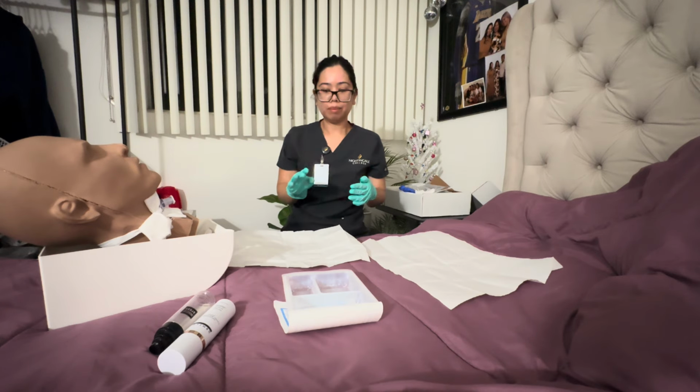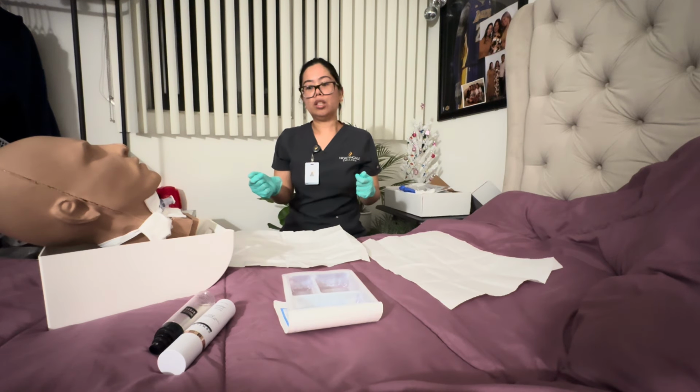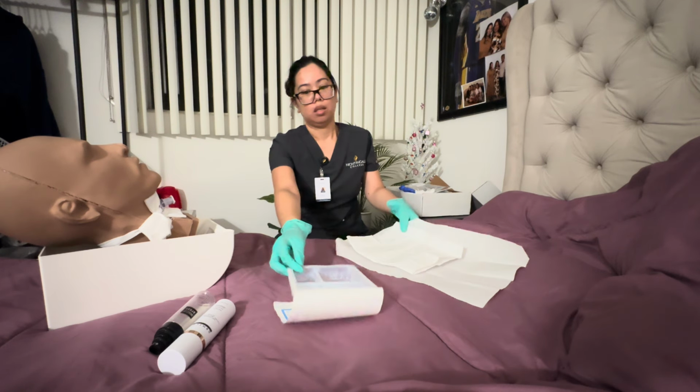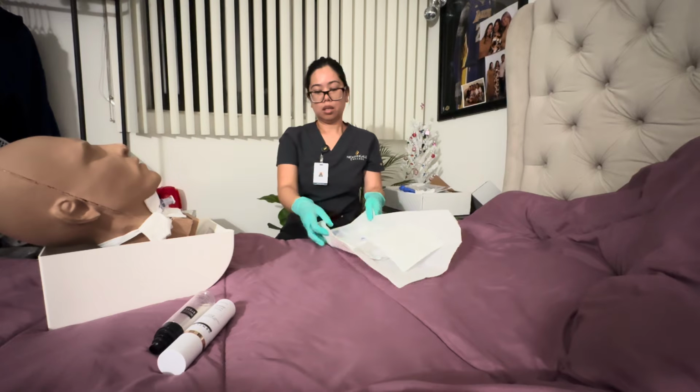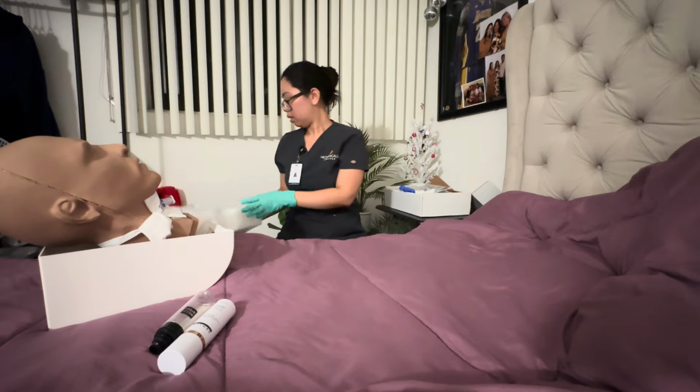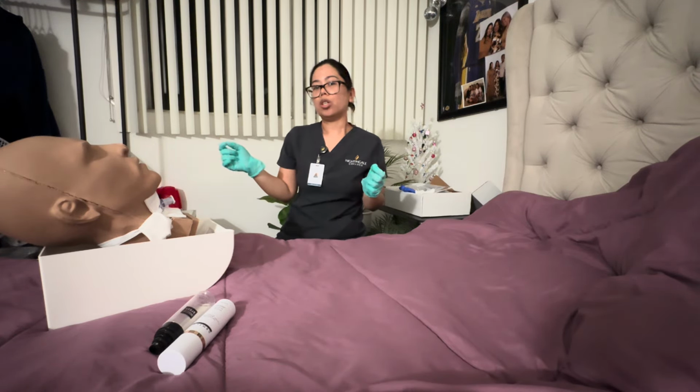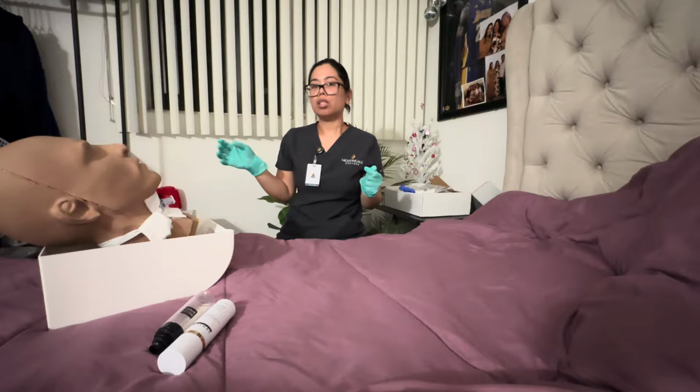We're gonna be discarding all of our trash. Okay, and then we're going to put the patient's oxygen back.